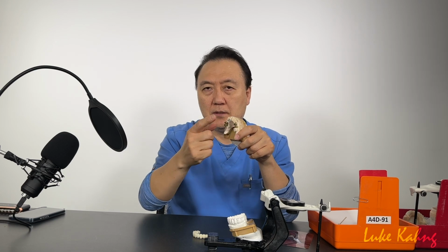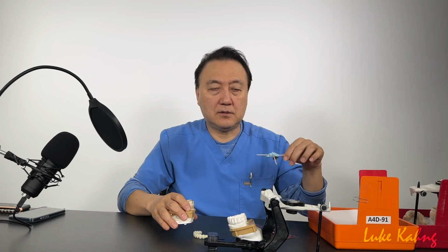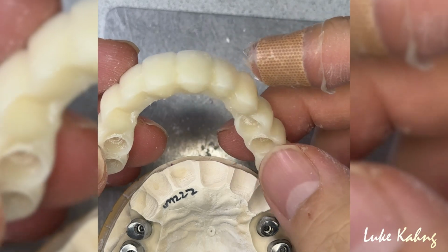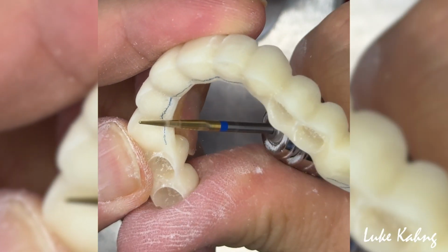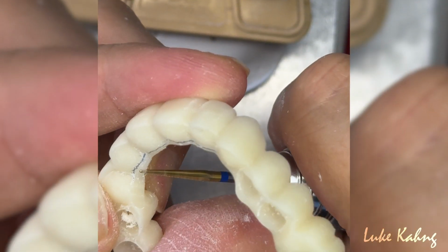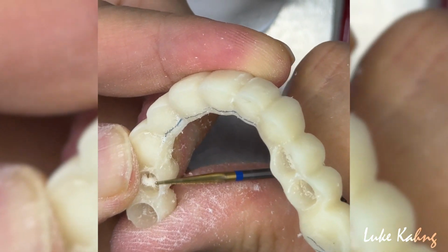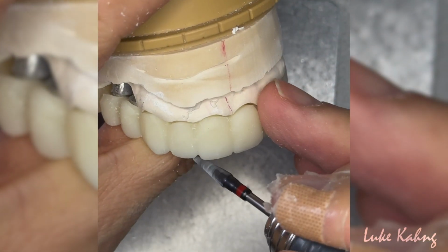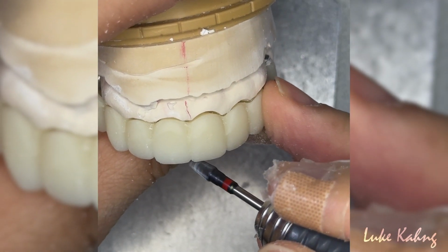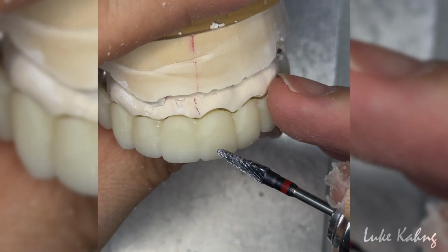So after this, we design after mounting, and the doctor gave us a good stick bite, the vertical and horizontal, and then we design and then we mill the PMMA. See my video, it's grinding, finally finishing the grinding. If I need to add more underneath, then I have to add more convexity, just like a football type. So the patient pulled out the teeth, they secure their position, and then 6 months later, that tissue area will be beautiful, and so we'll get really good cleansability.